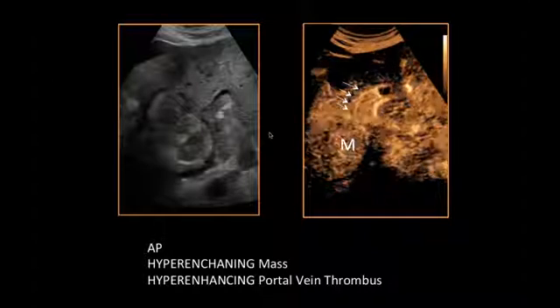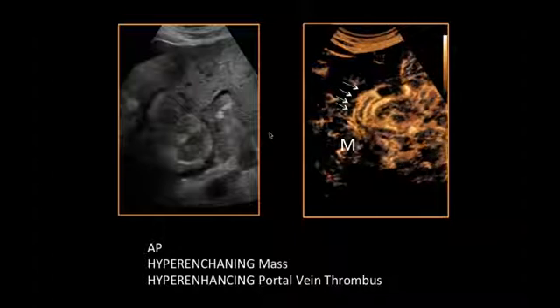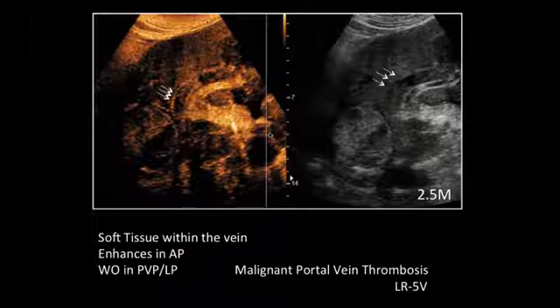And so LRM is a group of lesions that have malignant enhancement characteristics, so that they're either definitely or probably malignant. However, they are not specific for hepatocellular carcinoma. So let's look and see what we have when we're looking at LRM, a very important category. So this lacks the specificity for hepatocellular carcinoma. And as Dr. Pisgaglia nicely described, these lesions can have variable arterial phase enhancement, but especially rim enhancement suggests LRM.